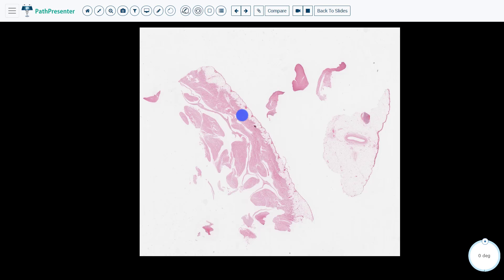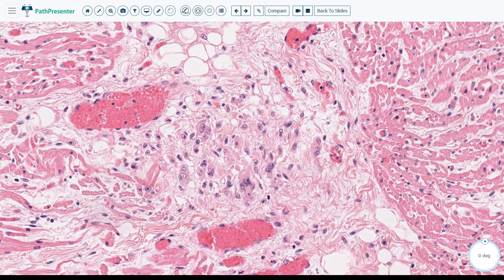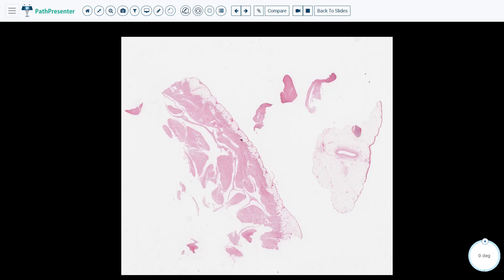The pancarditis in acute rheumatic fever is mediated by cross-reactive inflammatory processes generated as a result of the Group A Streptococcus pharyngitis. This is a cluster of macrophages and T cells known as an Aschoff body, which is very characteristic of acute rheumatic fever. Some of the macrophages have elongated chromatin — the cells with elongated chromatin are known as Anitschkow cells, which are also commonly seen in the Aschoff bodies of acute rheumatic fever.